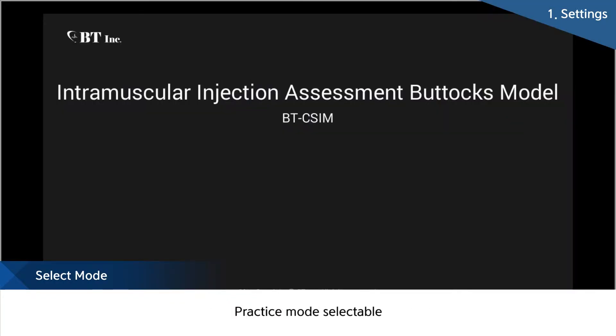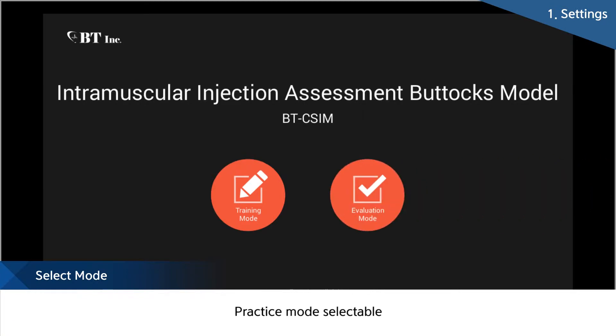First of all, BT provides training mode and evaluation mode that can be chosen depending on the educational purpose. The training mode supports user self-practice, and the evaluation mode is for evaluating exercises, enabling real-time evaluation of training and the checking of results after training.